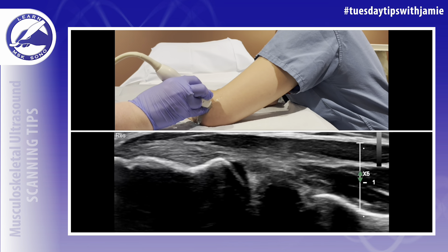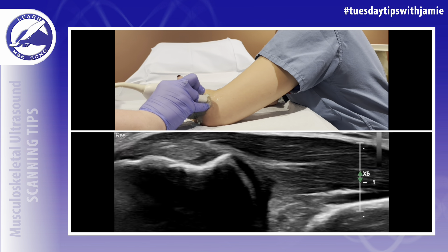Now watch the technique on this split screen.